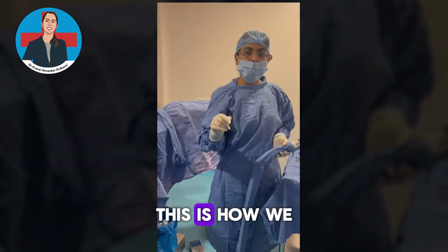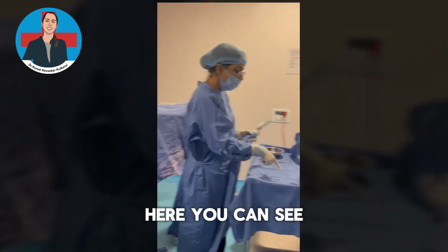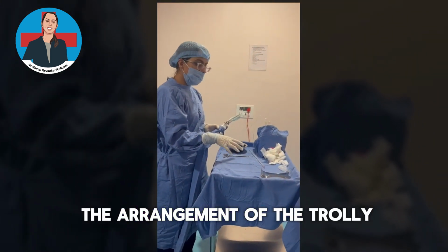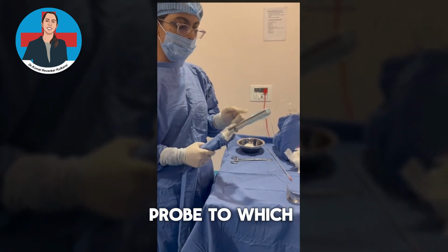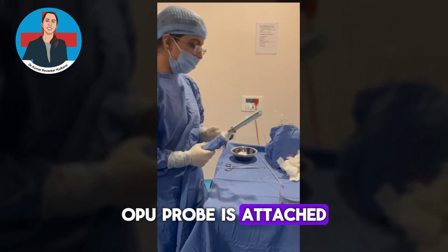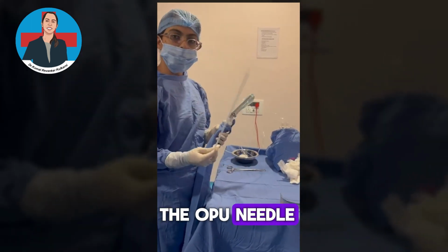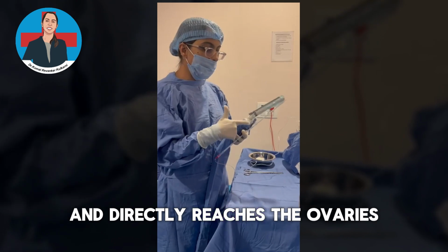How do we proceed with the procedure of egg pickup? Here you can see the arrangement of the trolley, which has a scan probe to which the OPU needle is attached, OPU probe is attached, and then this is the OPU needle, which is a long needle. This pierces through the vagina and directly reaches the ovaries.